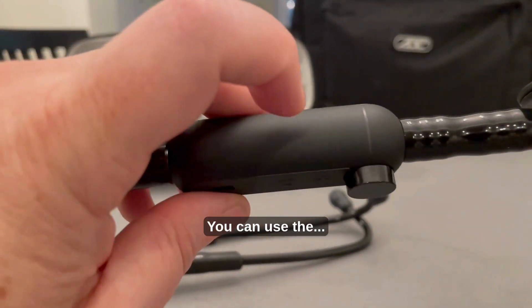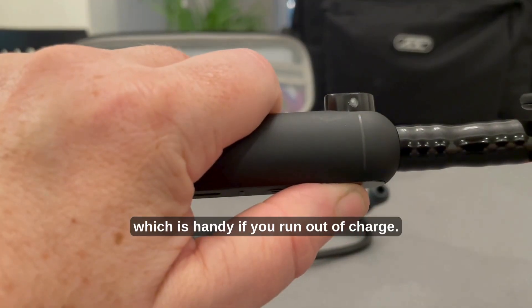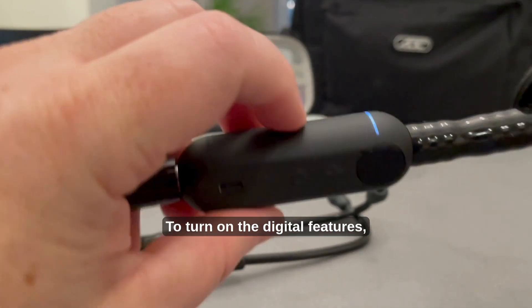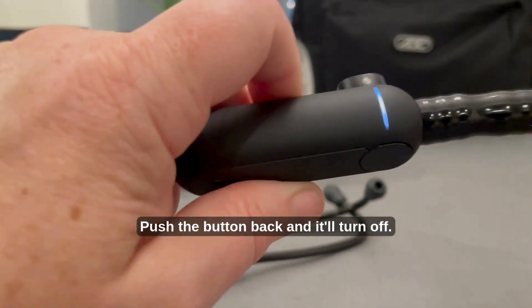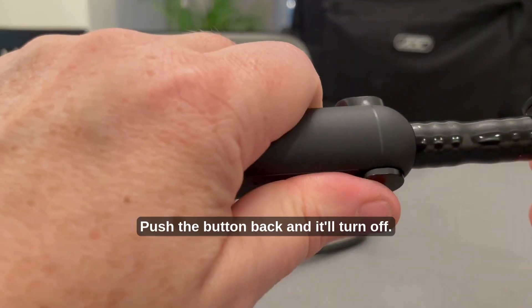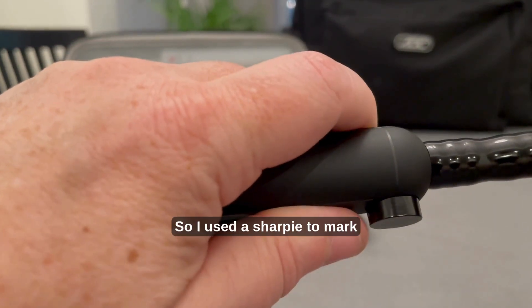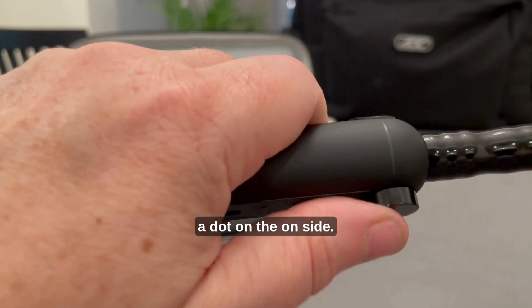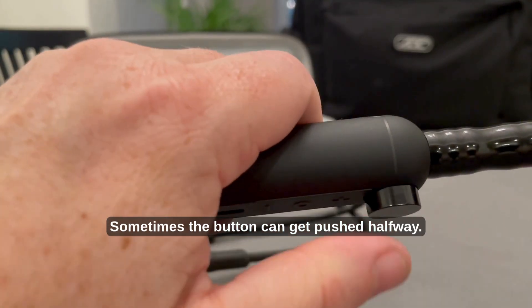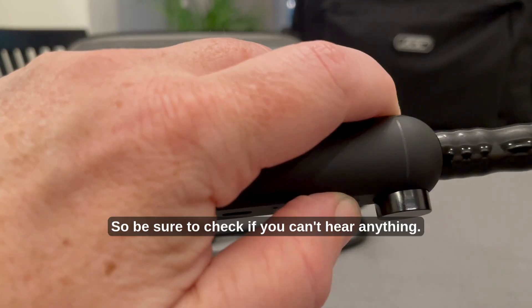You can use the stethoscope without the digital features, which is handy if you run out of charge. To turn on the digital features, push the button and the white light will indicate it's on. Push the button back and it'll turn off. I kind of wish there was another indicator for when it's on, so I used a sharpie to mark a dot on the on side. Sometimes the button can get pushed halfway, so be sure to check if you can't hear anything.